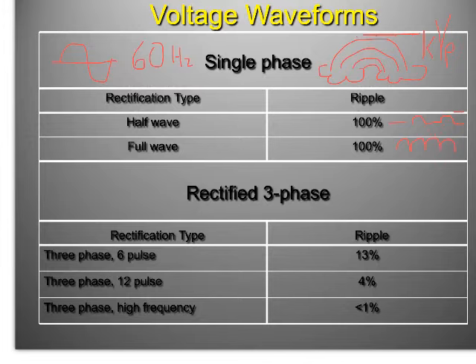It is phasing out the power. So now I don't just have one waveform entering the machine, I have 3 waveforms, right? I've got 3 waveforms entering the machine. So as one of them starts to fall off, the next one's pitching into action, right?